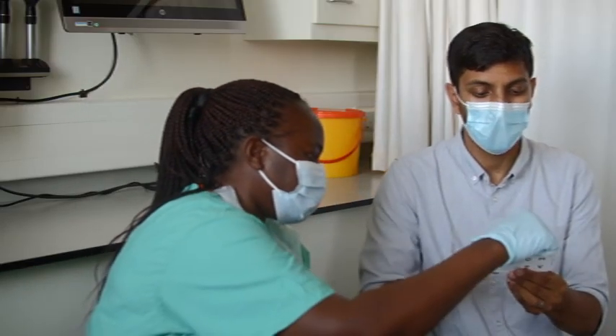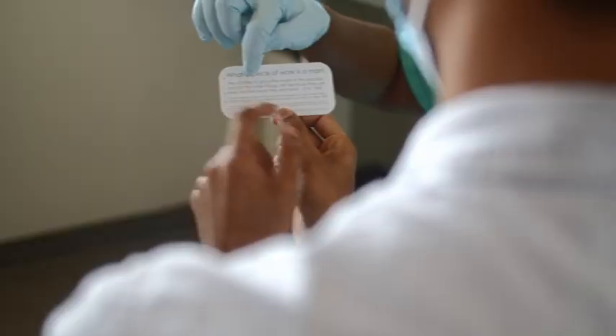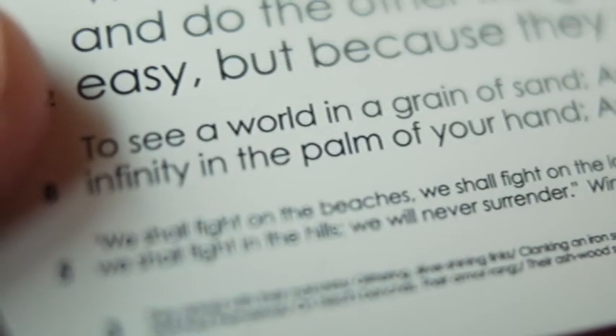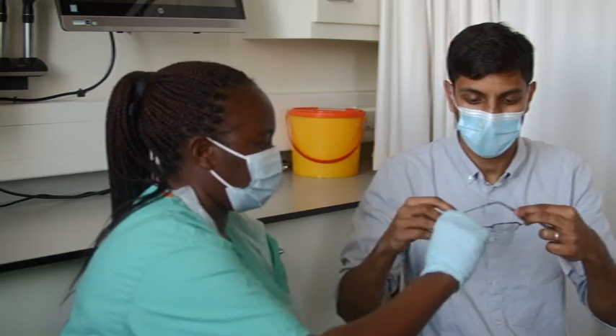Ask them to read down the chart with both eyes together. Record the smallest line they can read comfortably. If they cannot read the N8 line then try with plus 1.5 diopter sphere glasses.